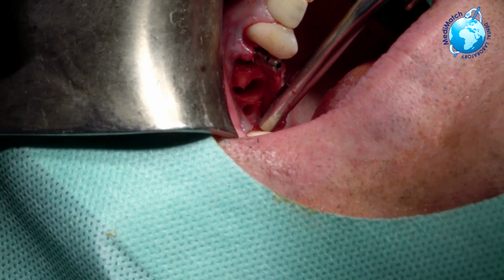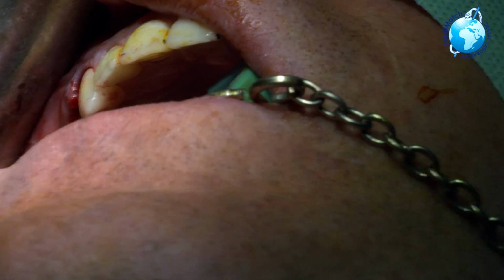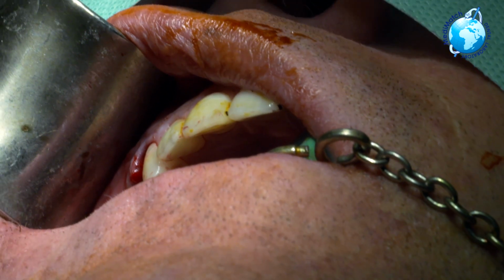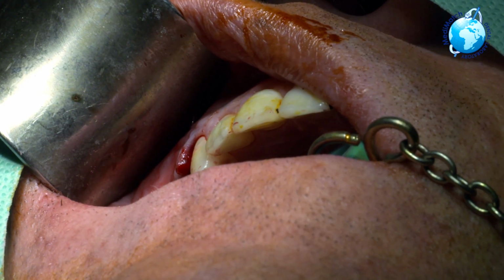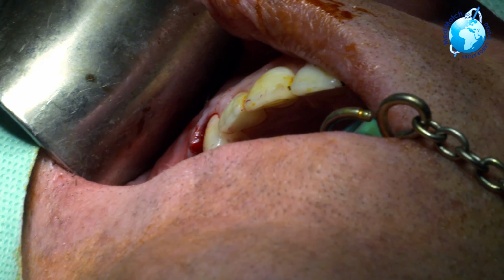Yeah, 4.5. Okay, one second. Let me check a 4.3. Okay, just checking depth. Just get a 10 stopper, easiest way. Okay. Have a wee little feel. Open, Alan. Sorry, Alan. Boom. That's no perforations. That's absolutely spot on what I wanted.